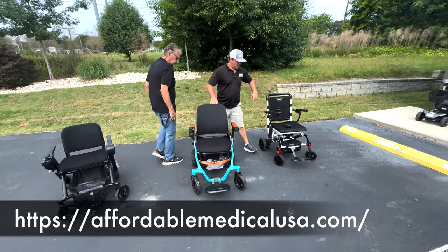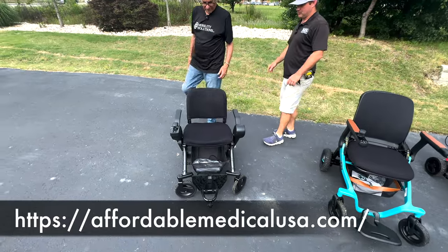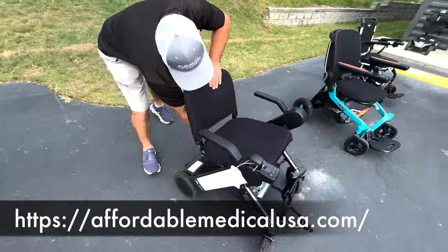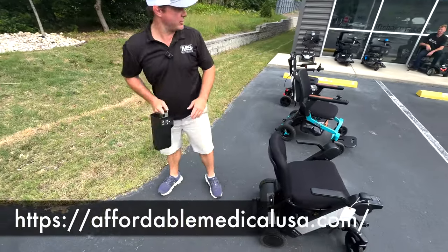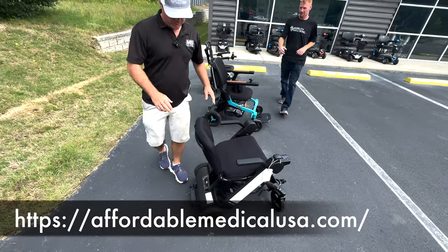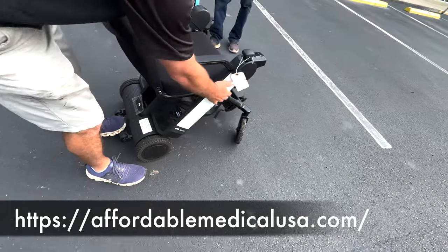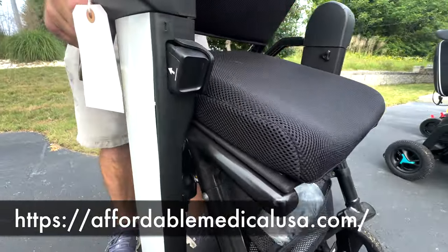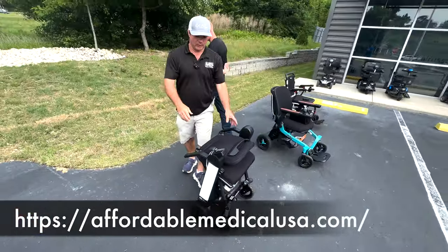So let's go ahead and fold up the FI. You remember how to do that one? So how to fold the FI up. If you want to reduce the battery or the weight, take the battery out, put that to the side. Josh, you're going to come here with your foot. There's a latch back here. And then this is folded up. Okay? So this can be rolled.